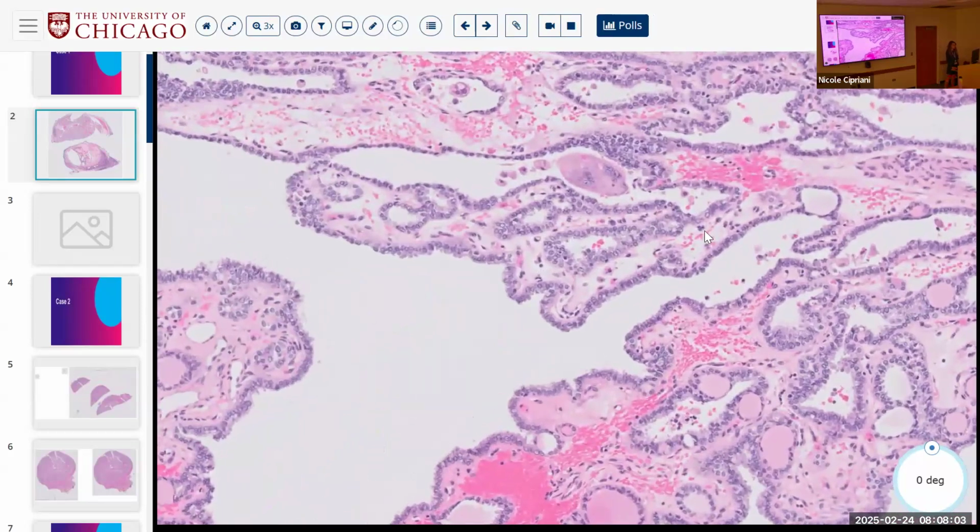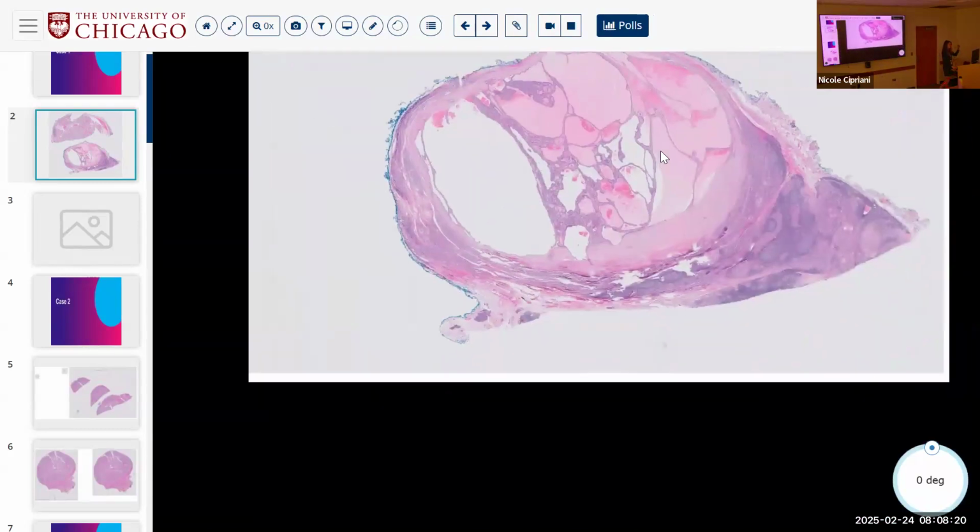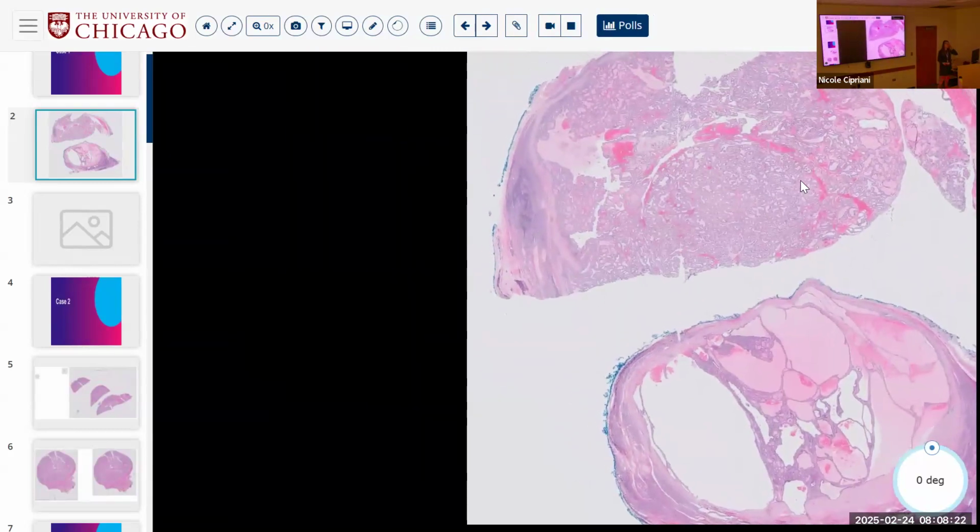And it's these kind of structures that to me maybe aren't really papillae, right? Because you have follicles in the core, which isn't really by definition a true papillum. And so I'm starting you off the bat with probably one of the most controversial questions, because I think you will go out into practice, and if you are signing out thyroid, you will encounter this and you will want to know how to deal with this.